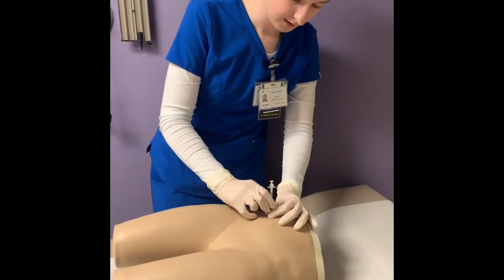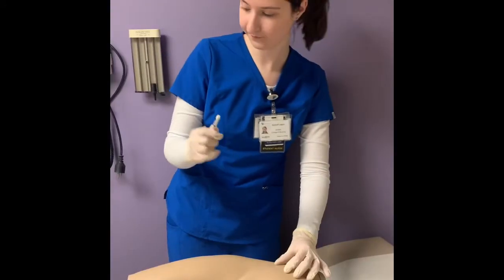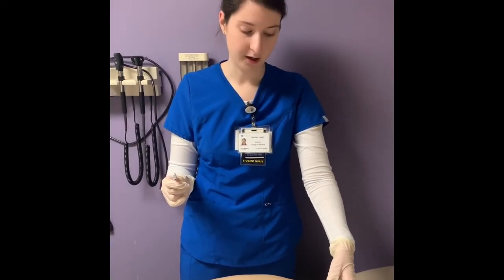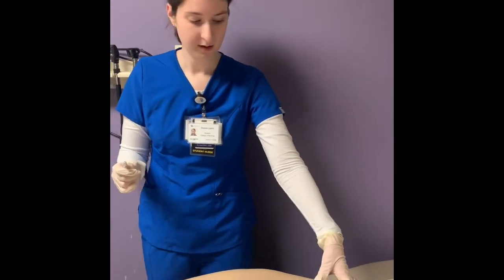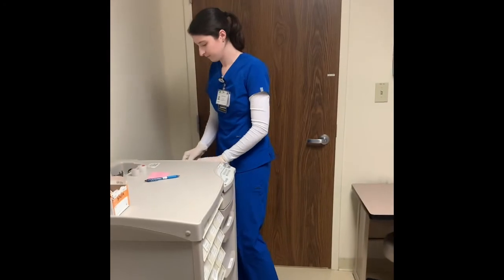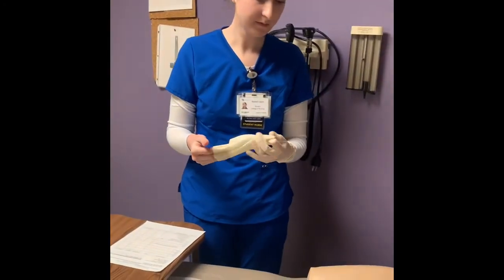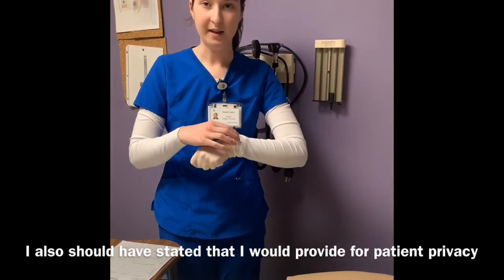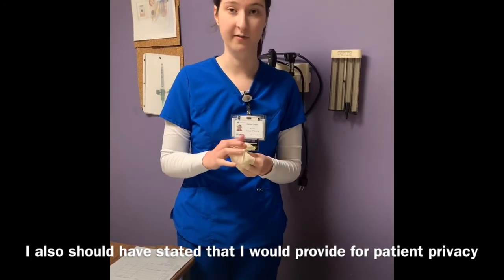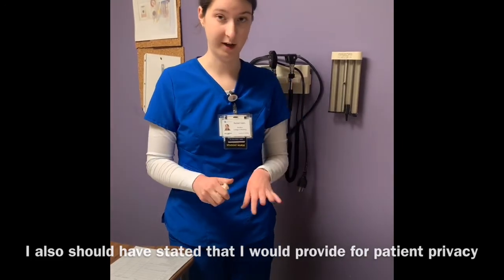Okay, now I'm going to go ahead and remove the needle, engage the safety. I would apply pressure if there were to be any blood or any fluid return after removing the needle. Okay, now I'm going to dispose of this in the sharps container. Okay, I'll remove my gloves. Oh, and I should have stated at the beginning that I would have adjusted the bed to be the correct height for me to easily work, and I would have lowered the bed rails on the side on which I am working.